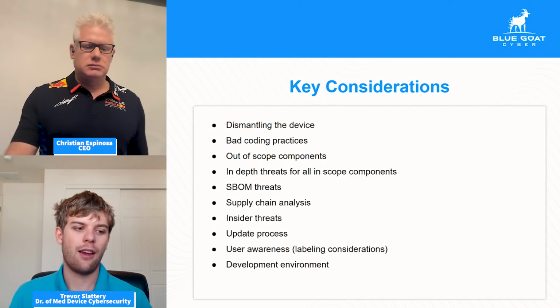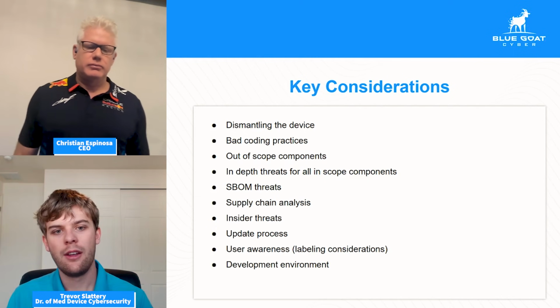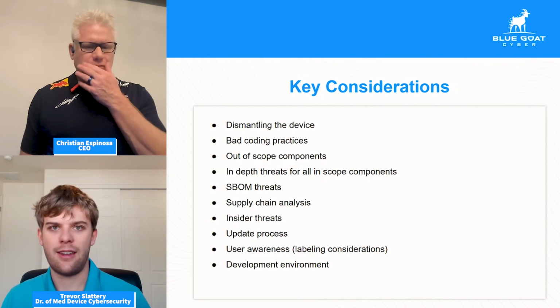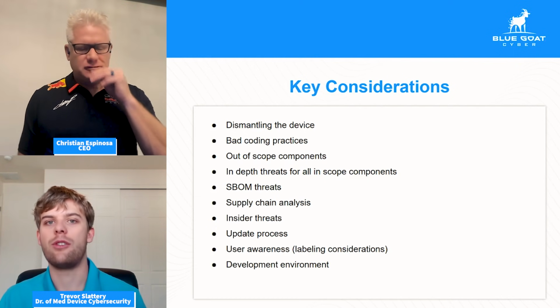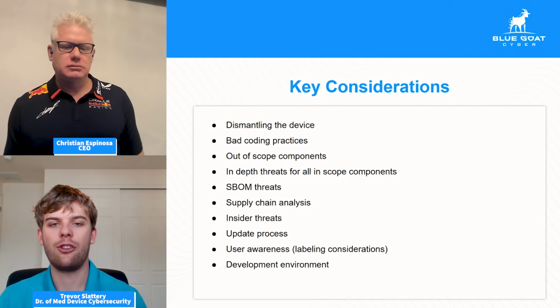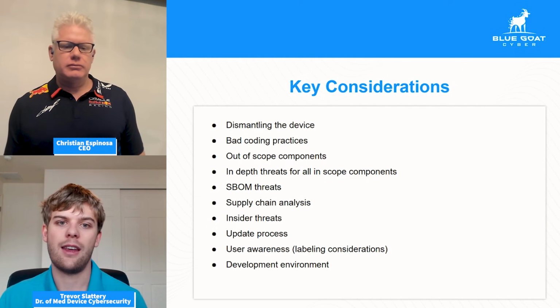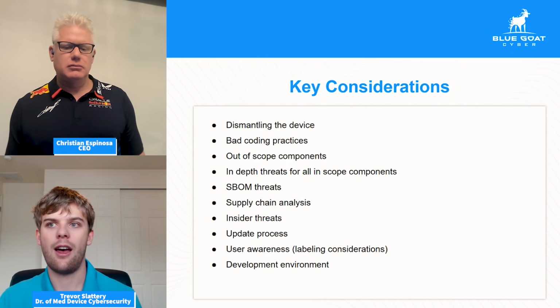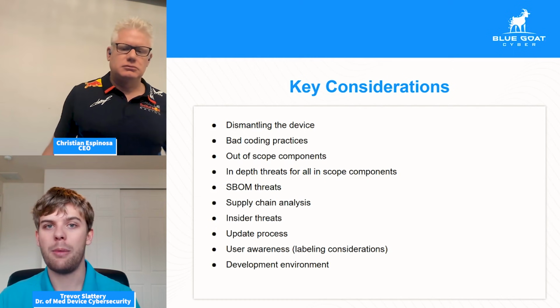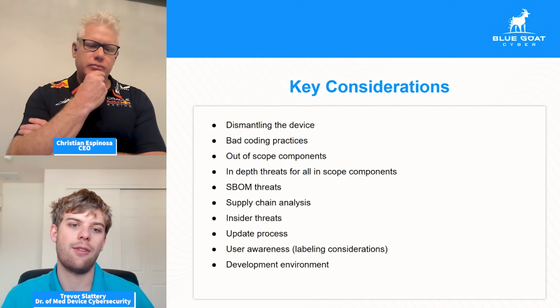This is another area that we see all the time: threats are just high level. There aren't many threats against each component. It's just trying to act as a tick list instead of trying to introduce security into the system. Taking that checkbox approach is not good for the security of the device, and it's not good for the clearance of the device. It certainly increases the risk of a rejection by the FDA and massively increases the risk of vulnerabilities getting introduced into the system that are not caught by risk assessment and threat modeling activities.